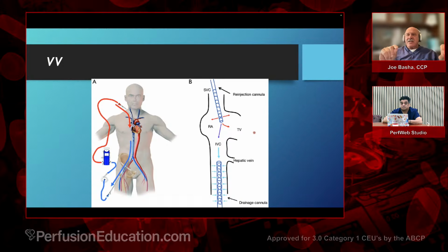And that is a patient that is severely hyperdynamic. If their cardiac output is 12 to 14 liters and you're flowing 4 or 5 liters on your ECMO, the washout is so fast that you really don't have any recirculation. That is the only time you would see recirculation of 0. The time you would see recirculation that is very, very high, despite perfect cannulation, is when you have heart failure, cardiac failure, or you are flowing higher than the patient's cardiac output.